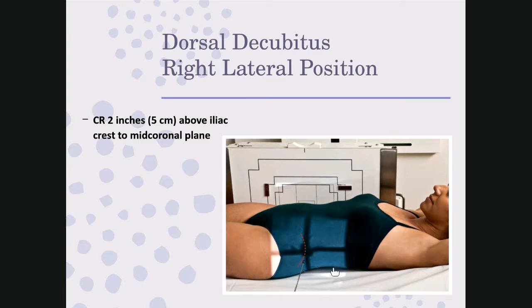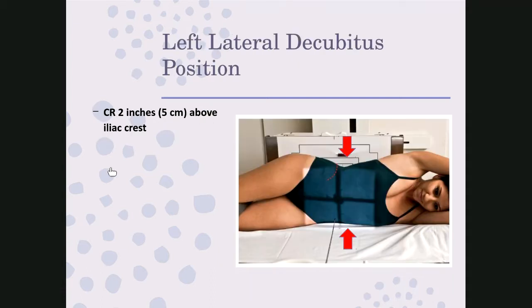Okay. One thing I did not mention that I intended to on these decubes, anytime you have a decubitus, you always mark the side up. So in this particular image, they should have a right marker, which I'm quite sure that's what this is. But you would want right side marked because the left side is down.